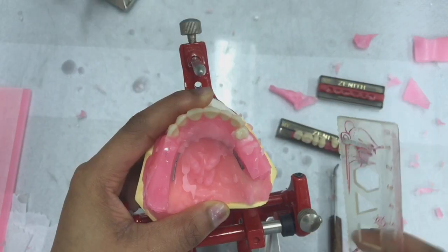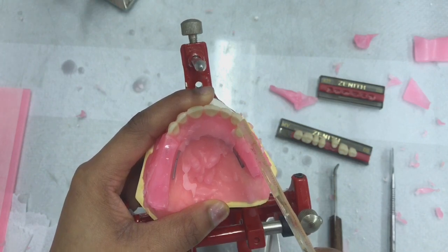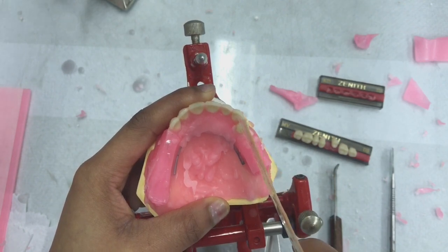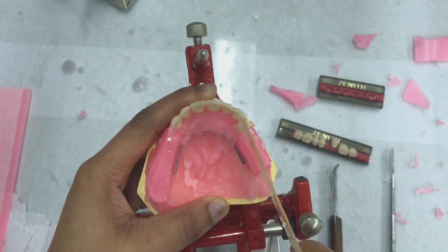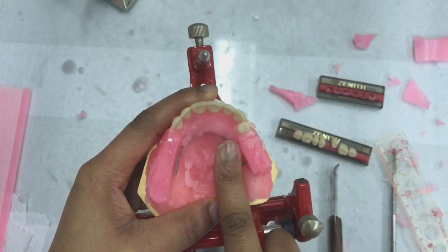To check that I've placed it in the correct way, I'm going to look from above and place my ruler at the middle of the canine's cingulum, and I'm going to ensure that my ruler is in line with the 2 millimeter distal line at the back, and this ruler should run through the premolar's developmental groove. Okay, and that is the case. So I'm happy with where I have positioned my premolar.